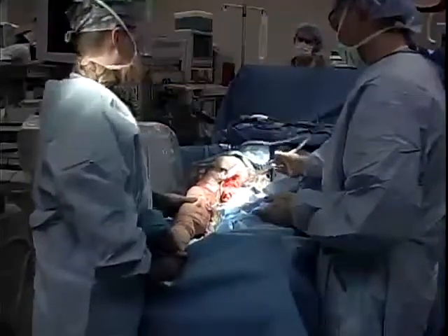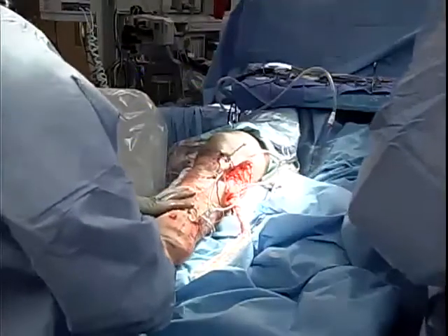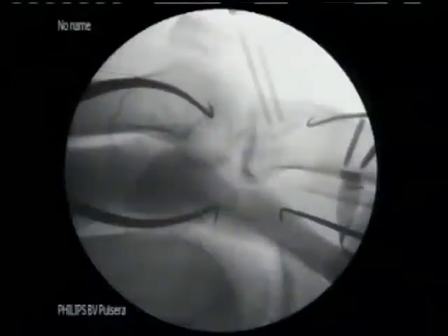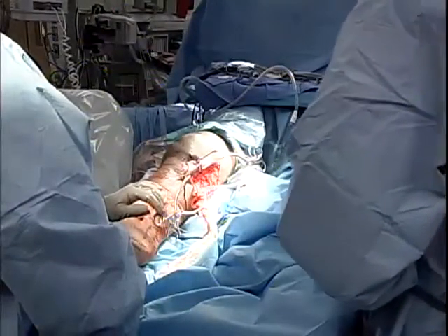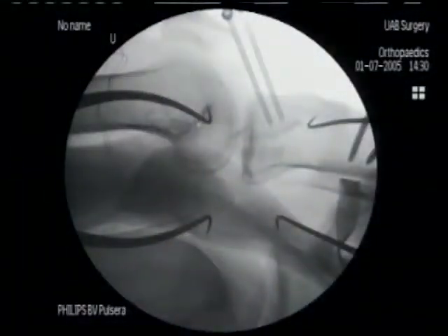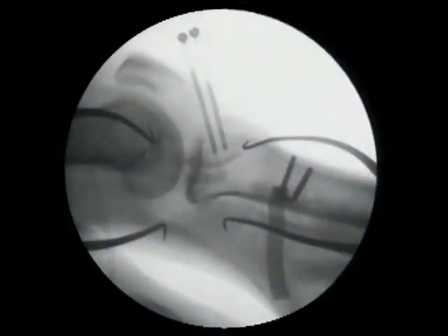The first step is obtaining a good lateral of the knee using fluoroscopy. This is critical — spend enough time to get it exactly right. You'll need to adjust both the knee and the fluoro machine. I use the posterior aspect of the femoral condyles and try to line them up to confirm an adequate lateral. We're making fine adjustments to achieve a perfect lateral and correct rotational alignment.